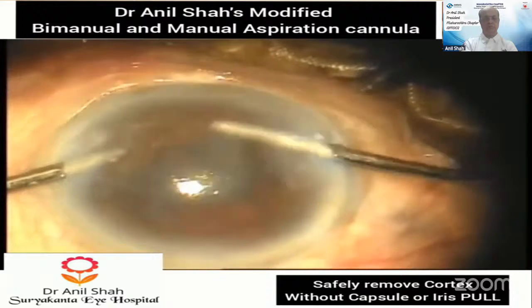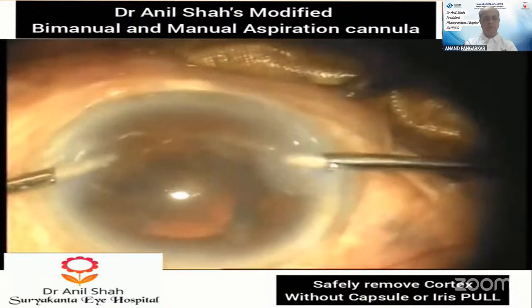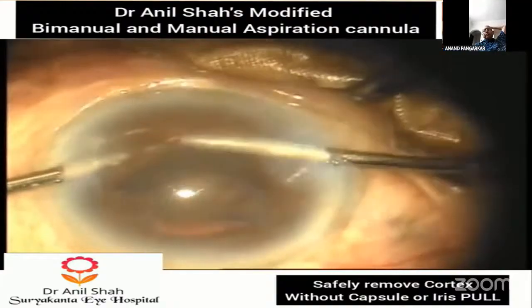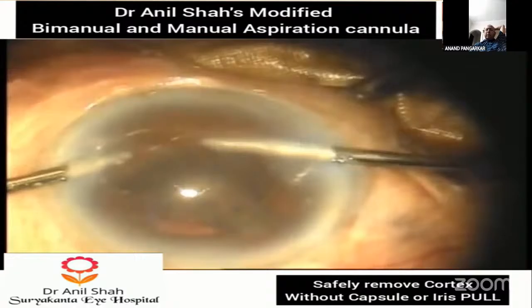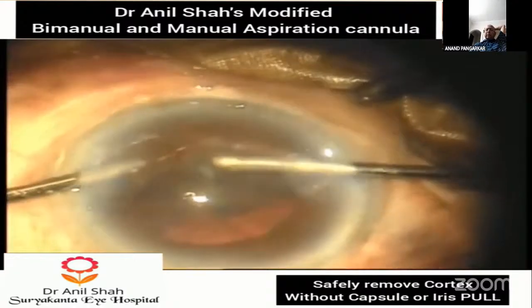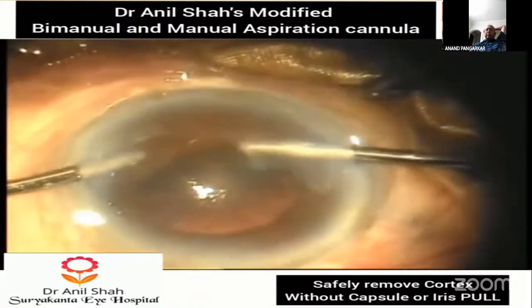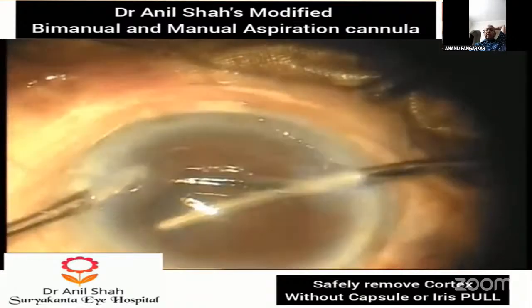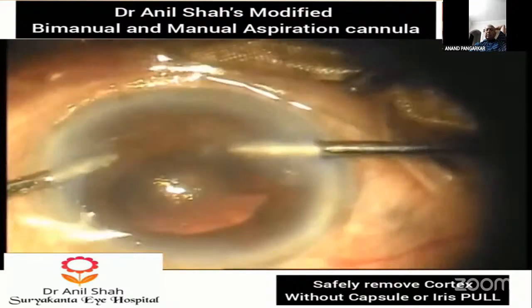It is very simple and safe method, I think. It doesn't cause any damage to posterior capsule or even doesn't cause any pull on the anterior capsule, and you can blindly go below the iris and take out the cortical matter easily. See, in the fornices also the cortical matter is removed blindly without any problem.